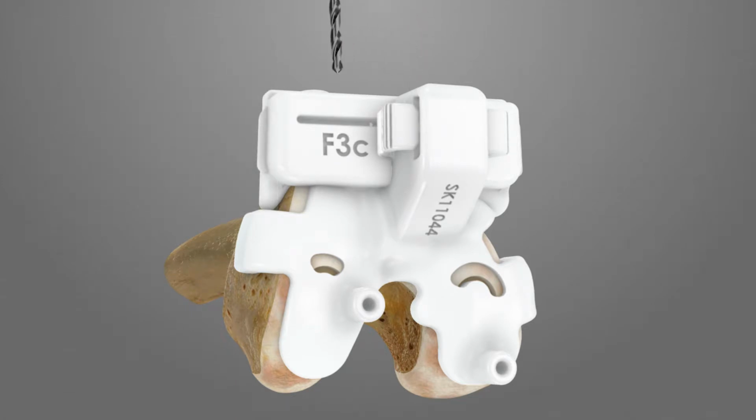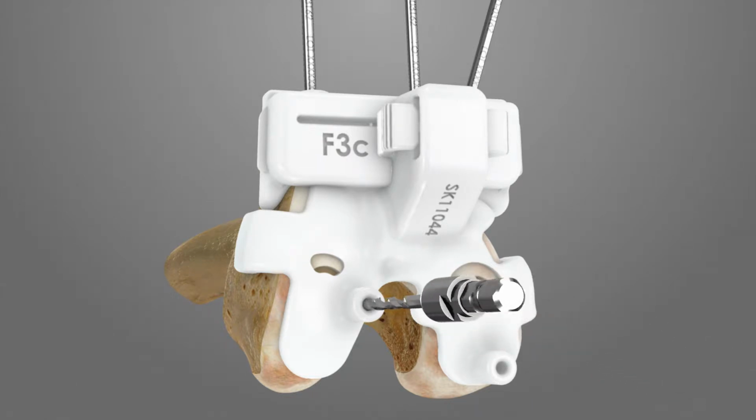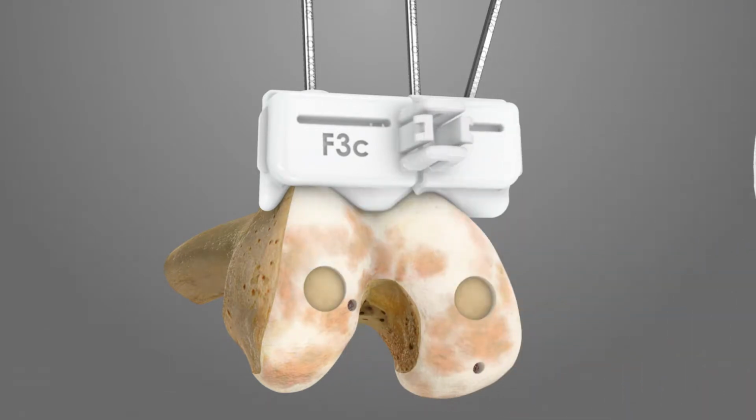Drill through the anterior parallel pinholes of F3C and insert two Steinman pins. Then drill and place a Steinman pin into at least one or more of the cross pinholes of F3C using the 3mm drill bit. Next, drill through the two distal holes of F2. These holes will be used later as reference for the rotation of the AP resection iJig F4. Remove the F2 iJig by squeezing the release tabs on F2.